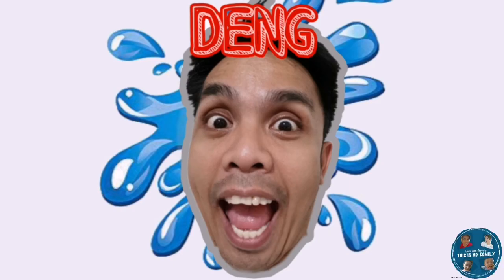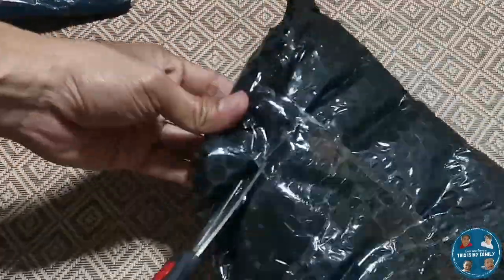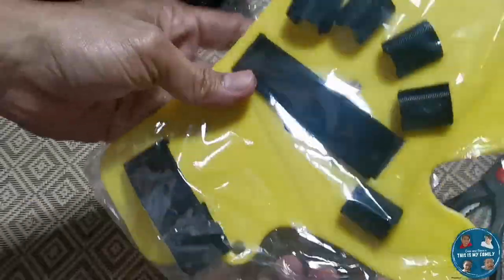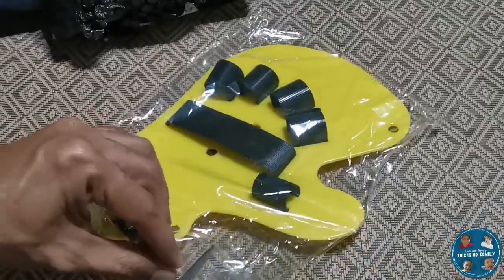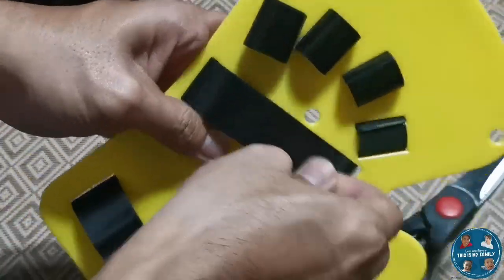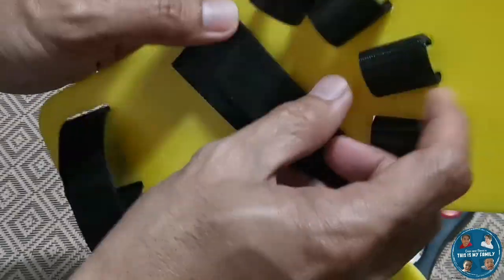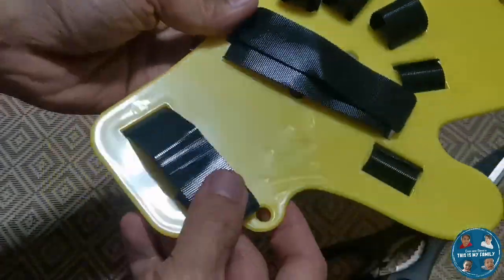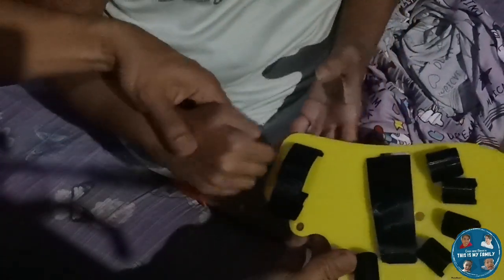Good day! Today we will be checking out the finger orthotics extended type adjustable finger board. This is to be used for stroke patients as a training support for their fingers, and is also considered an orthopedic brace. This extended type finger board is suitable for patients who have experienced stroke due to brain injury, cerebral palsy, or other cranio-cerebral diseases.